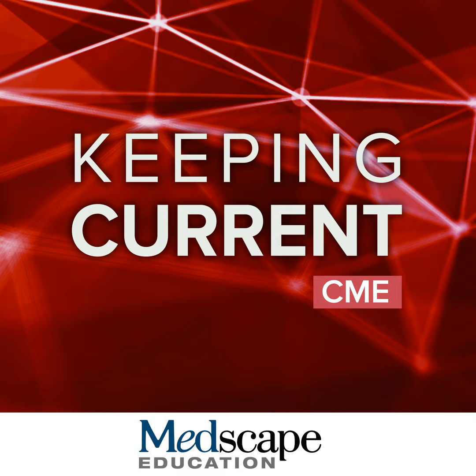So when you look at, for instance, just the clinical model, the age, sex, and the blood test, meaning AFP, by itself has a fair performance at predicting malignancy, about 0.73. This is in a test set, basically, so we did training, validation, and test set. If you look at the semantics model, meaning I call it LR-3 or 4, I provide also single semantic features like HBP hypointensity and, for example, diffusion restriction or APHE, that had also fair performance. However, when you look at the radiomics based on manual segmentation, the AUC was slightly better.